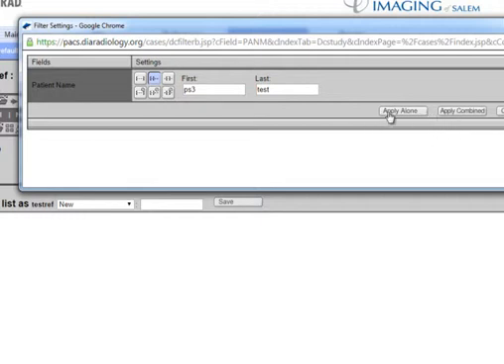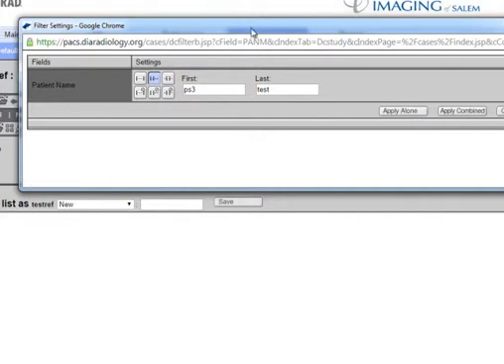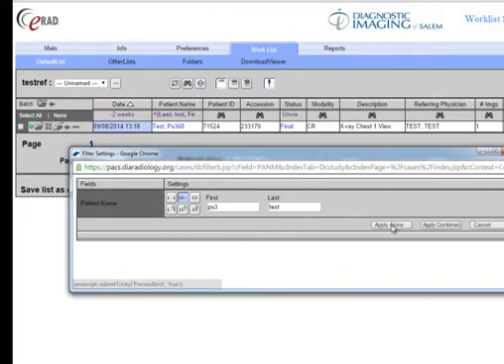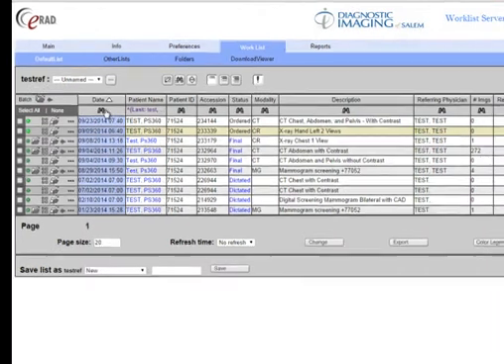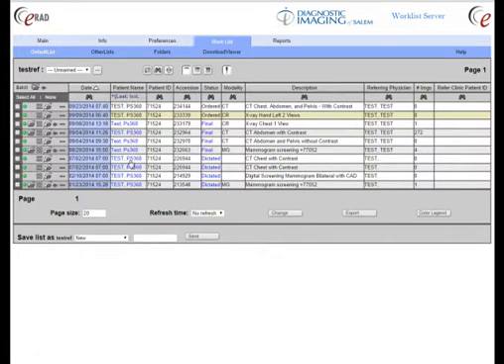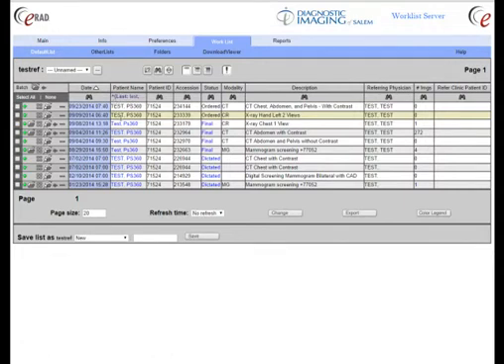If I'm only interested in this patient and just want to see the exams for them, I'm going to hit 'Apply Alone'. Apply alone wipes out any of the other filters — the status filter is gone, the date filter is gone — and I'm looking for just any patient that matches that name criteria.